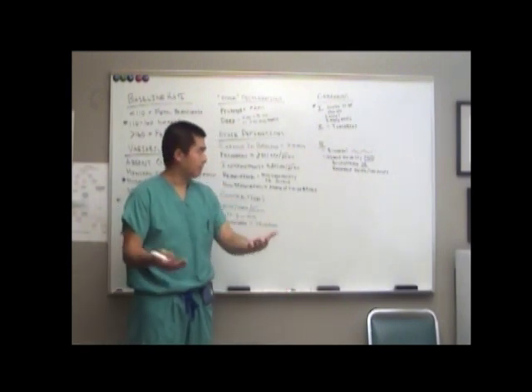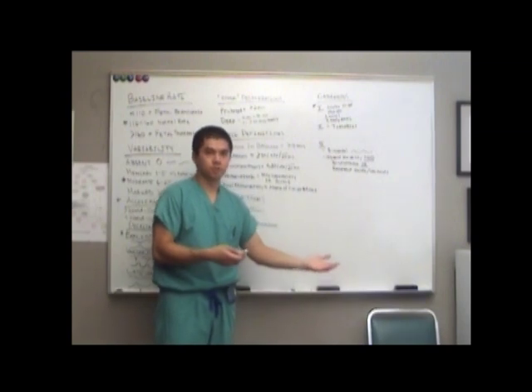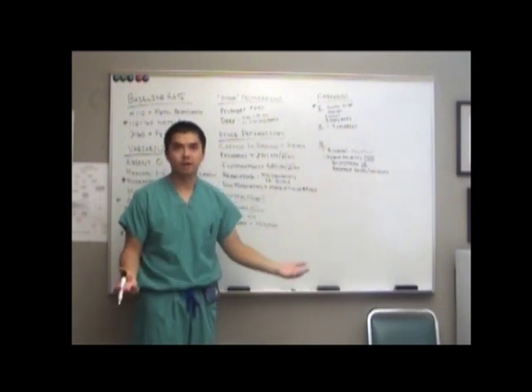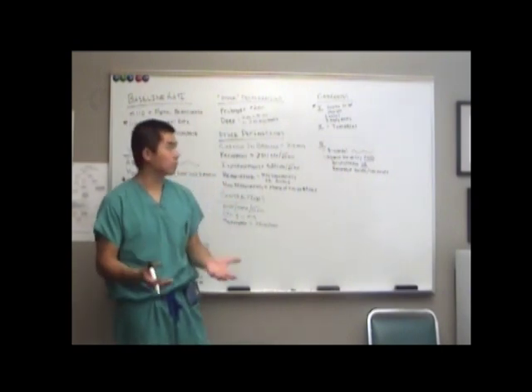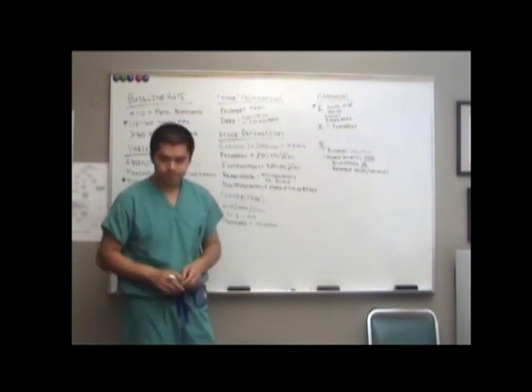And when they say bad category 2, that means, you know, like the heart trace I just mentioned, where minimal variability with prolonged decels down to the 70s or something like that, or something similar. So that's what they would consider a bad category 2. Again, it's still not a category 3, even though it looks awful on the screen.